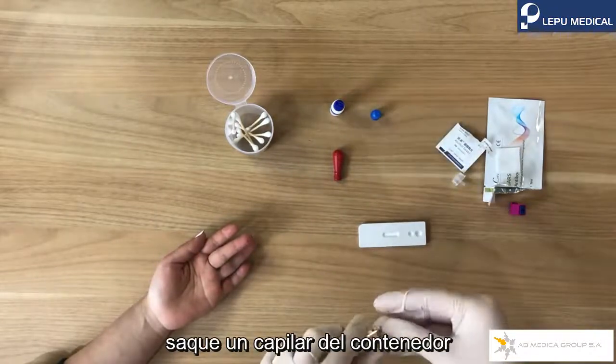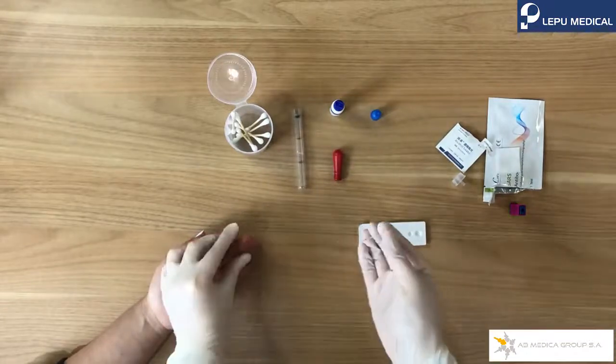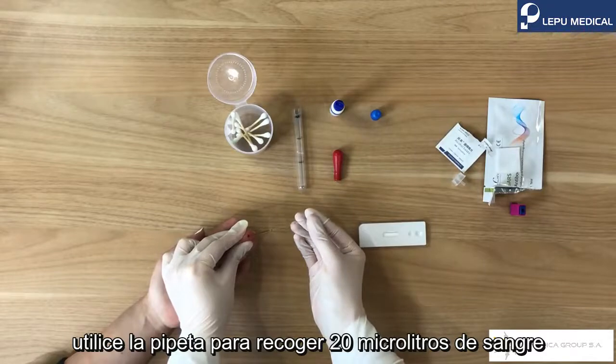Take one pipette from the container. Use the pipette to collect 20 microliter blood.